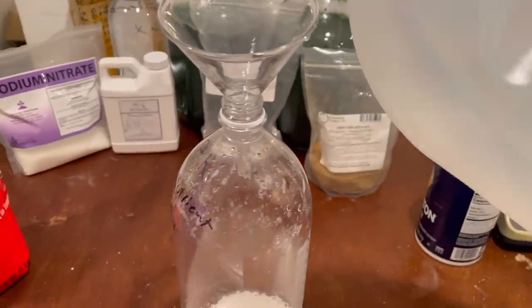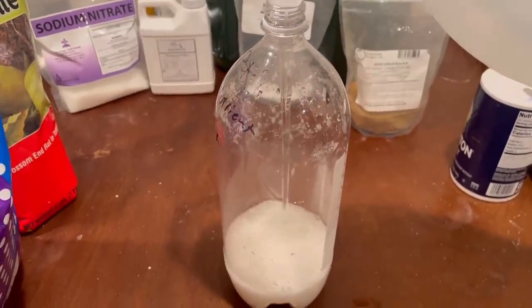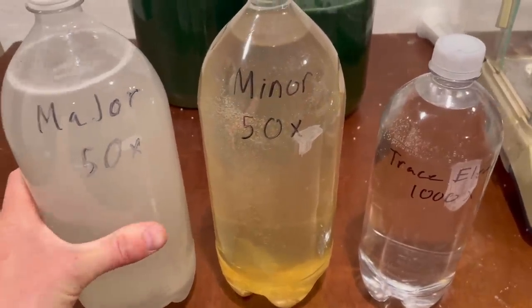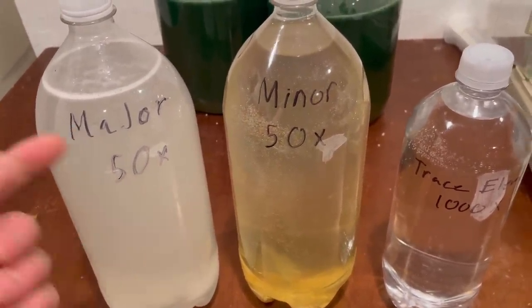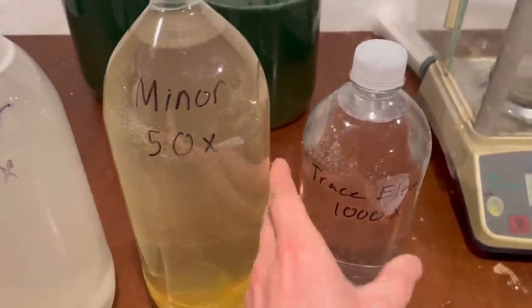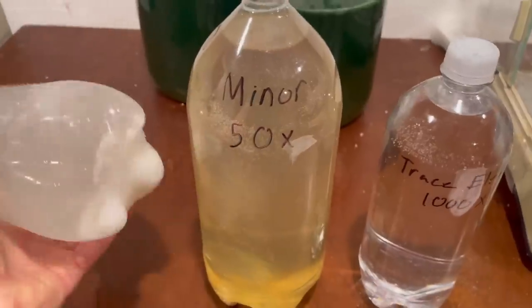Using distilled water, here are my three bottles — the three solutions. I decided to name them 'major' for the major elements and 'trace' for the trace elements.